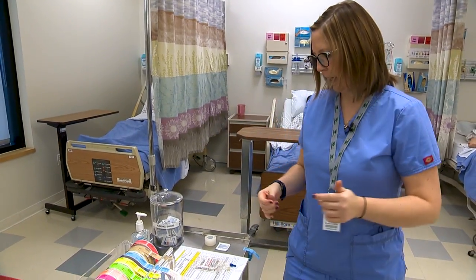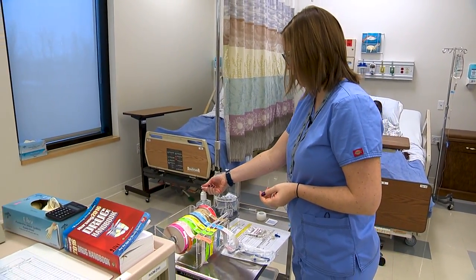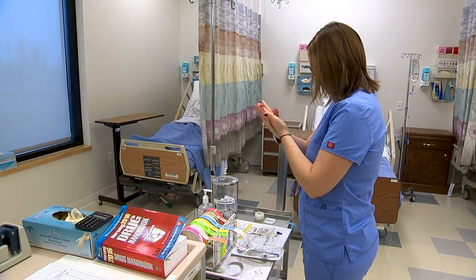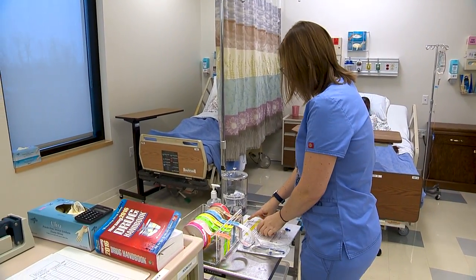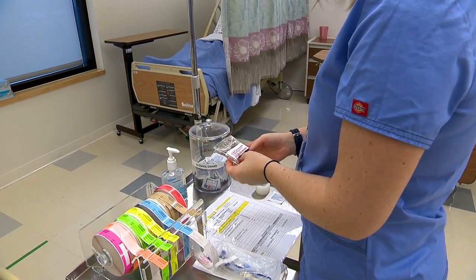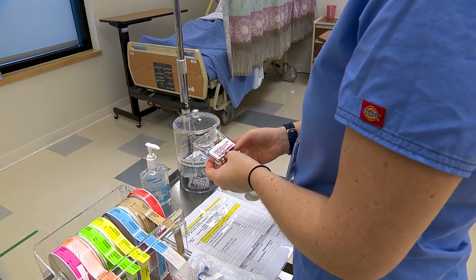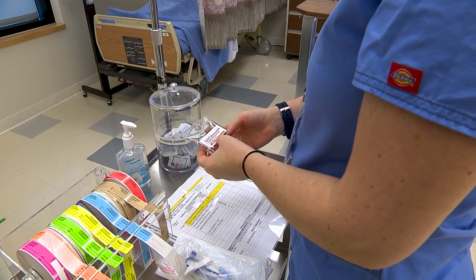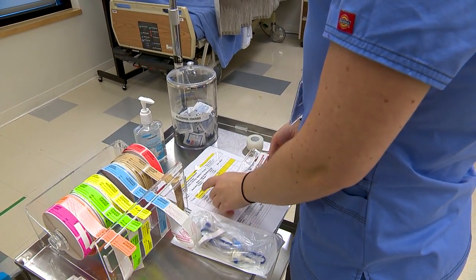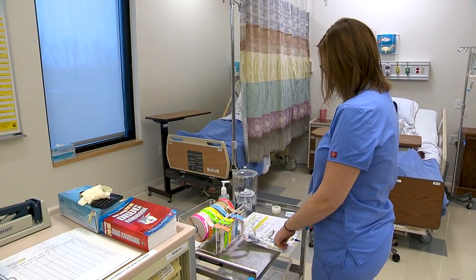Okay, now I'm going to prepare everything to go into the patient's room. So I want to complete my first check. So I have Morgan Brown, right patient. I have ciprofloxacin 50 mLs with 400 milligrams, which is the right drug and the right dose to give today at 9 a.m. via IV piggyback.